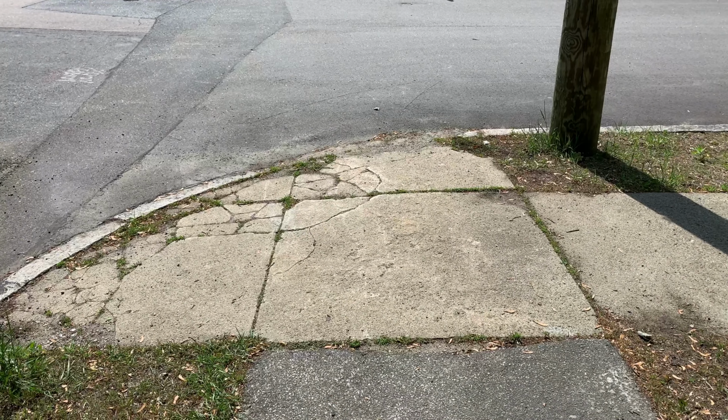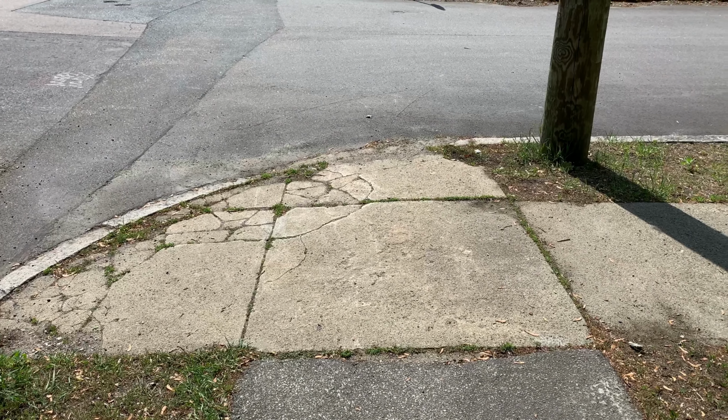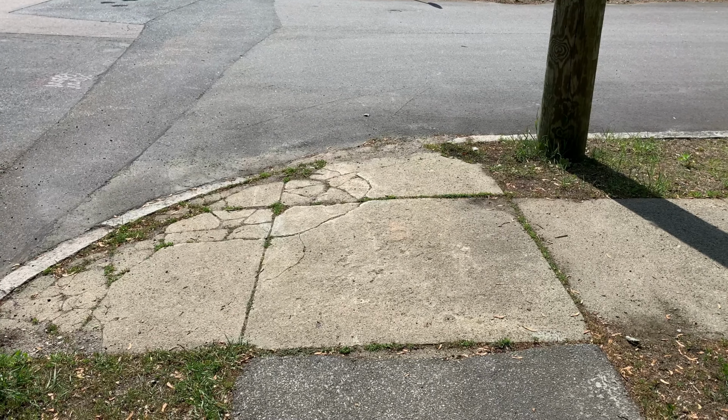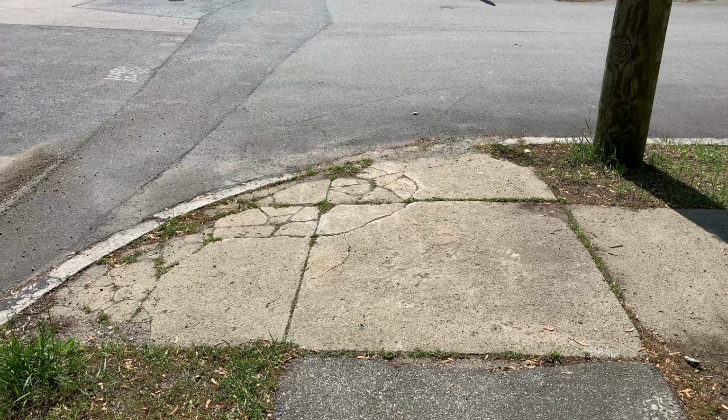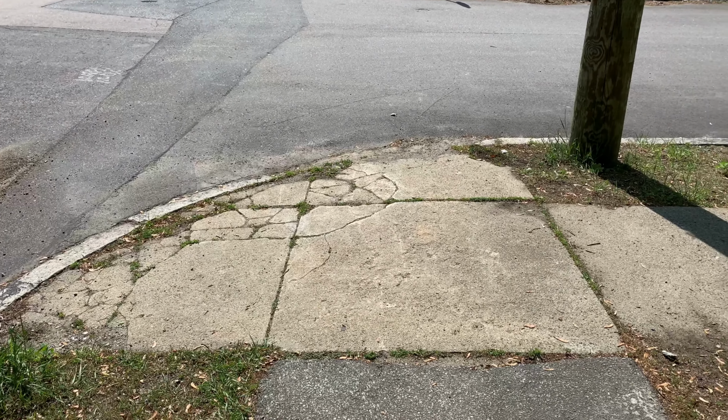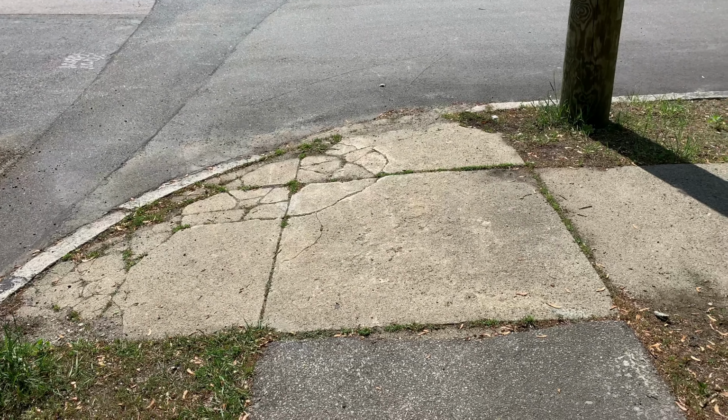And here's another quick example of a blended corner. This one, unlike the last one, has a little less of that curb between the blending of the sidewalk and the street to tell that it's a corner. But this one does have some slope down, so I can use that. And it also has a change in texture in that the sidewalk here at the corner is concrete, but the street is asphalt. So that could be another way of detecting that you are coming up to or at a corner. So I'm going to walk here with constant contact.